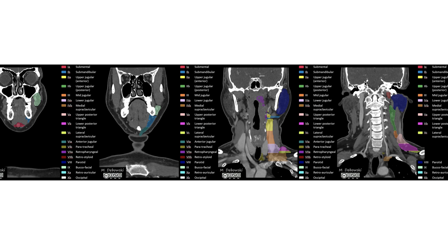This is a color-coded CT which demonstrates the lymph nodes in the head and neck. As we saw before, here is the submental and the submandibular, which are in level 1. Level 2 is seen here in yellow and green, which is the upper jugular. Level 3, which is seen here in orange, is the mid-jugular. And here is level 4, which is the lower jugular.